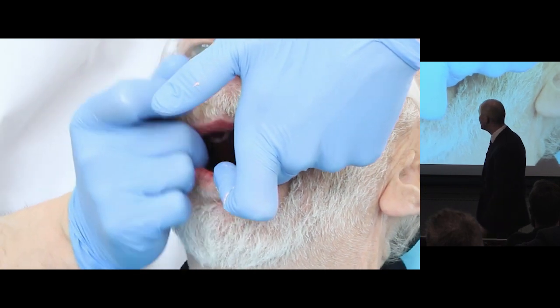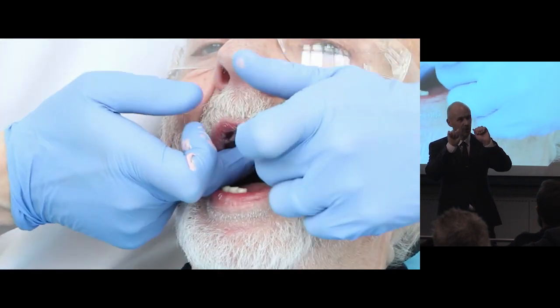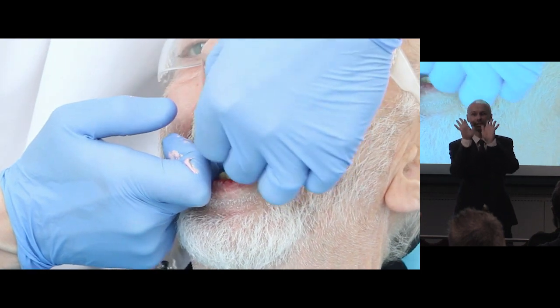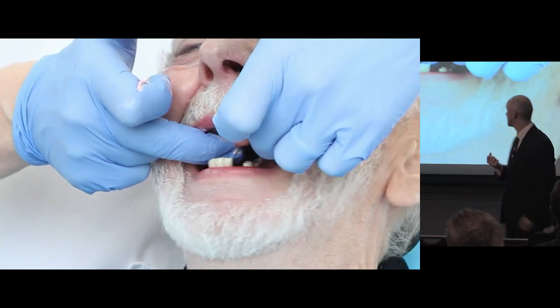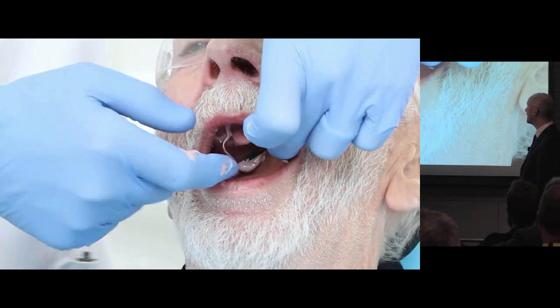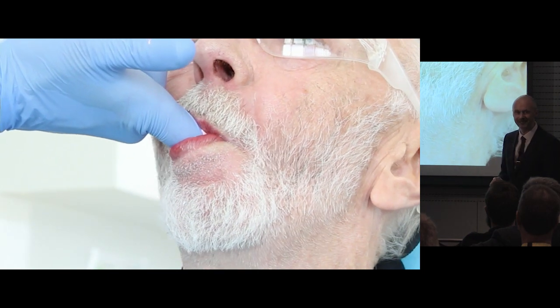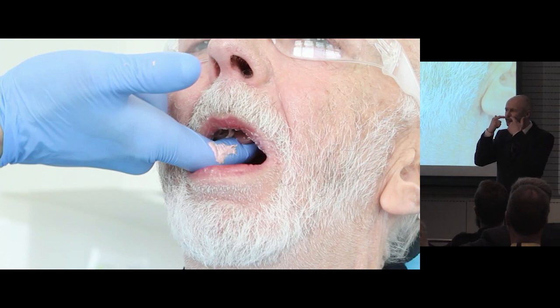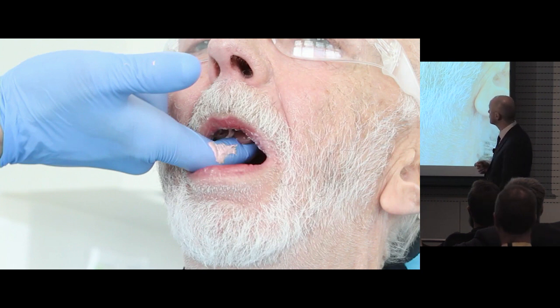CDTs in the UK say it takes time to learn how much pressure to put on for impressions. And I say just go for it. You've got to really push it down so it's fully seated, and then you can border mould, really go for it. So it's waggle the jaw, open really wide, and then I hold it firmly with my finger and get Bert to suck my finger. So it just contracts the modiolus just here, and that helps with that suction effect.